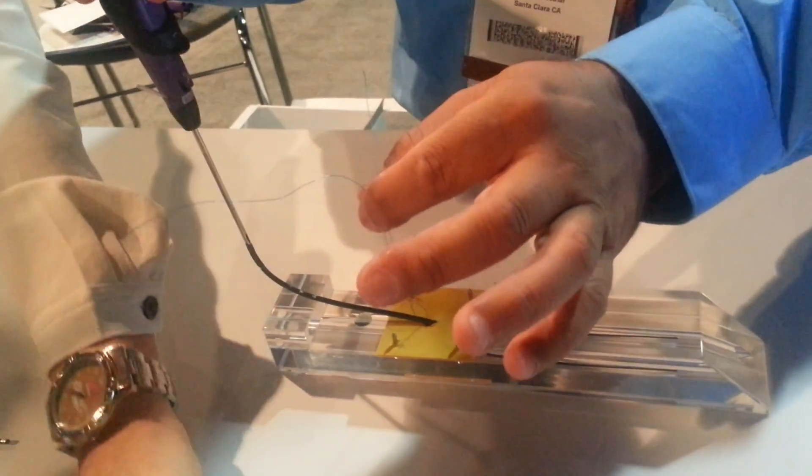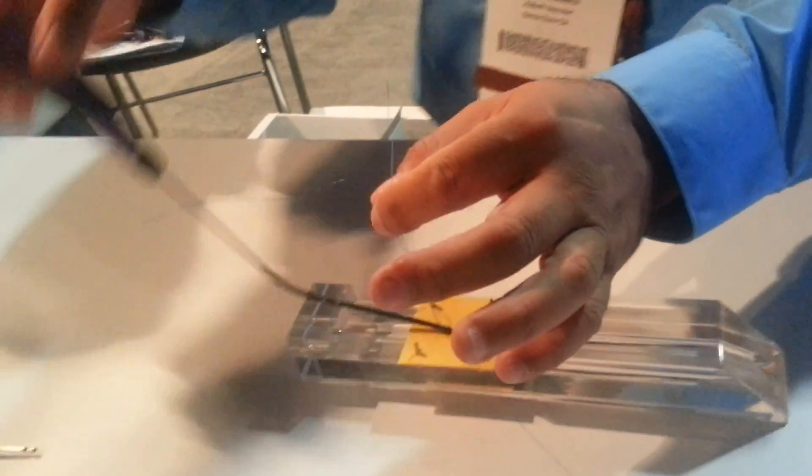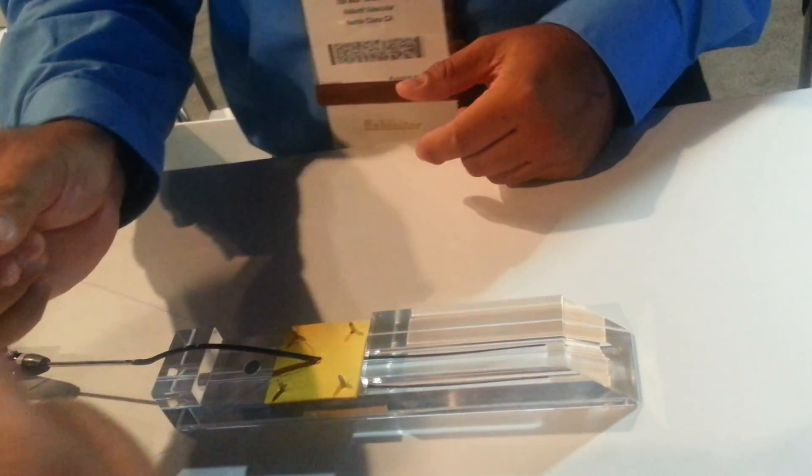This is your skin level — I want this at your skin level. Guidewire exit port. I will bend it like this because it lets me get the sutures out — that's the only reason. Grab your sutures. Rail, non-rail. White makes it tight. This one just pushes the knot.